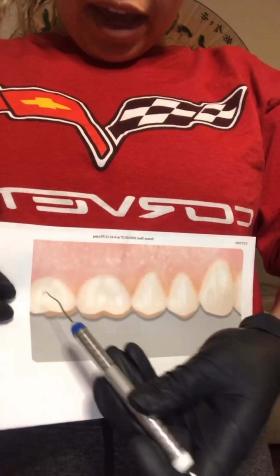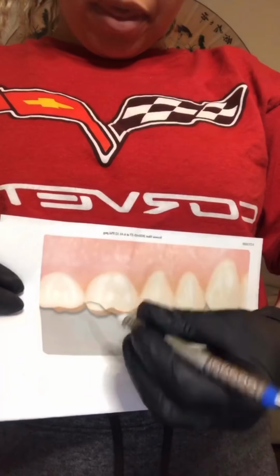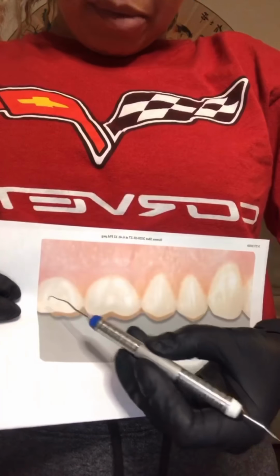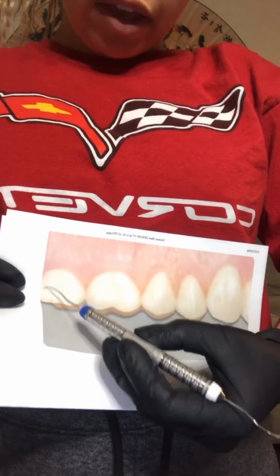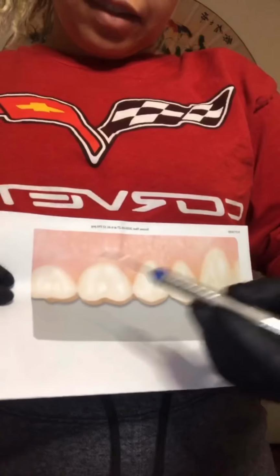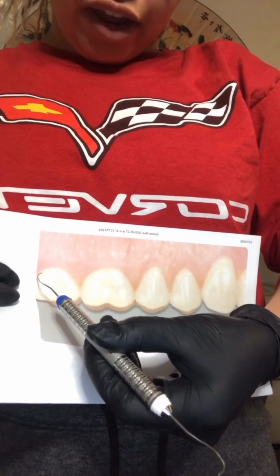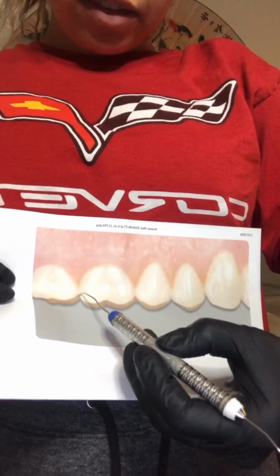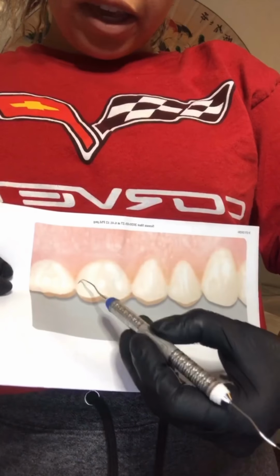Again, to find the right working end, this is the right working end because it's going over the tooth. This would be the wrong working end because it's going across the tooth. So I want to make sure that I am starting at the distal buccal line angle, making oblique strokes, rolling into the distal. Of course, I have my mirror to illuminate and to make sure I can see. And then I want to make sure I flip it, start back at that distal buccal line angle, oblique strokes as I roll into the mesial. And the next tooth, distal buccal line angle, oblique strokes into the distal.